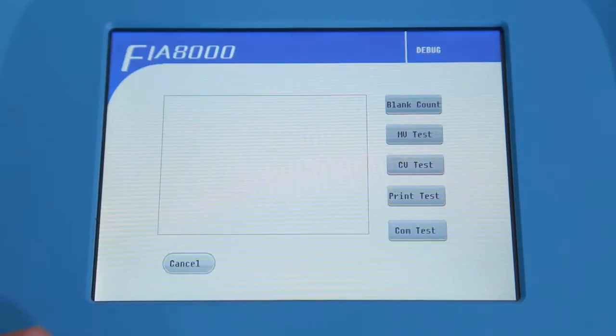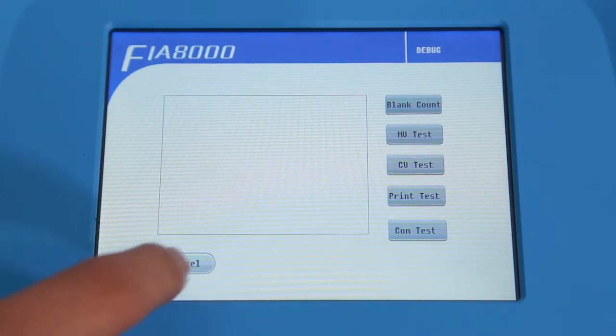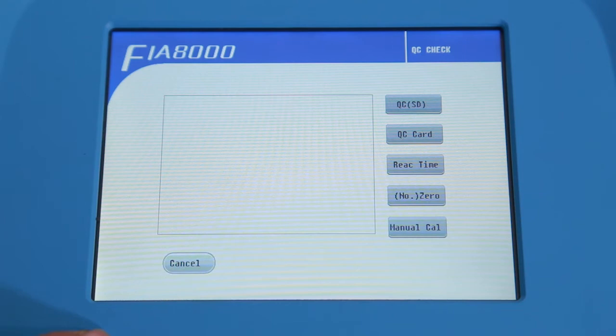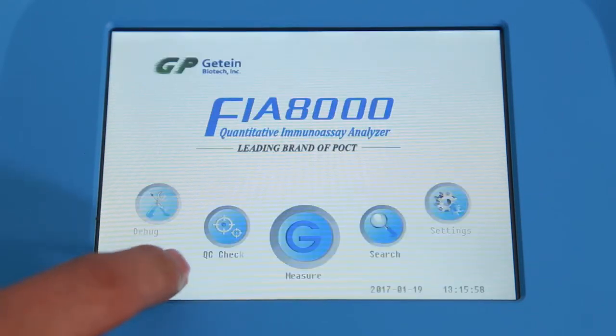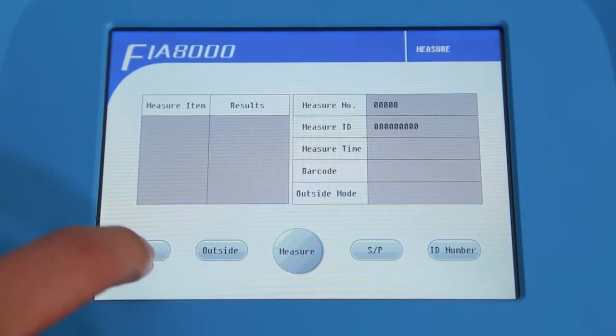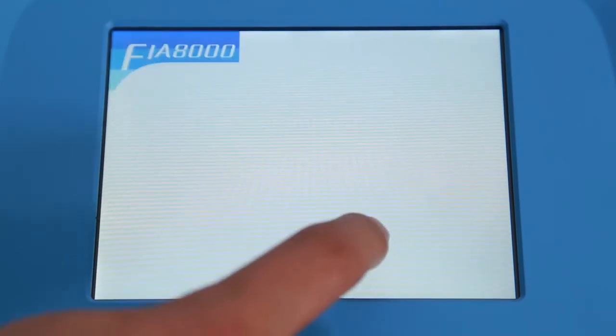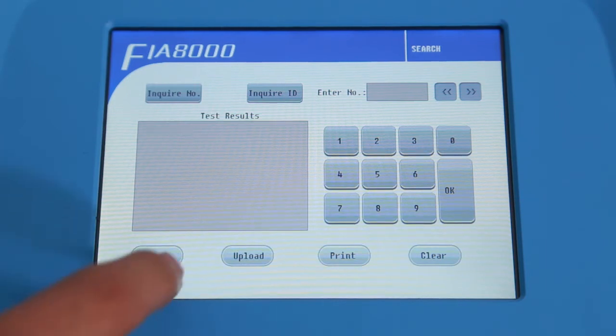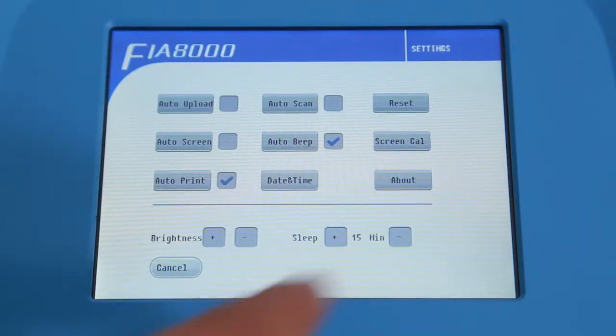Click Debug to adjust internal parameters of the instrument and to test common functions. Click QC Check to set internal parameters of the instrument to ensure accuracy. ID number, panel mode, and sample mode can be set on the Measure interface. Click Search to check saved data by typing in a test number or an ID number; the searched results can be printed out manually. Click Settings to set common functions of the instrument.